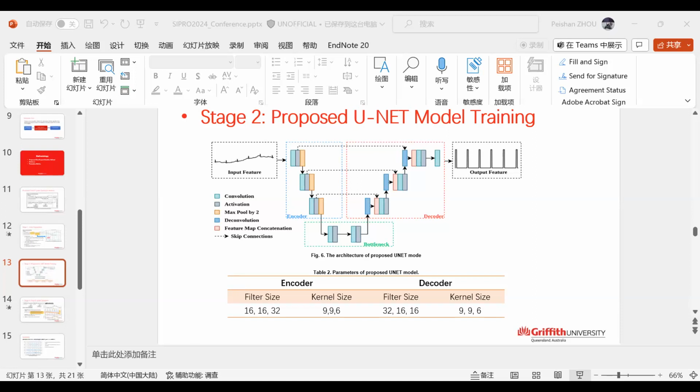For this first method, it makes the wrong predictions and also misses the true beats here. For the second method, it gets the true beats over here, but it is also influenced by the spike and makes one more false positive prediction. But our UNet is quite robust to the abnormal morphology, and we are all good with this.